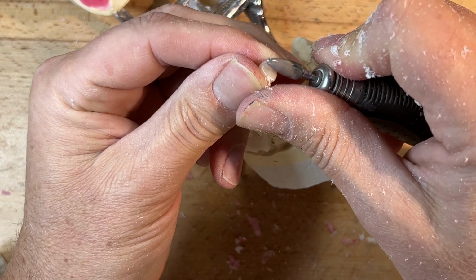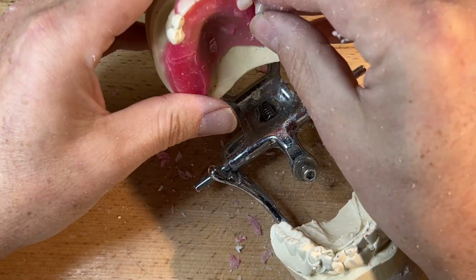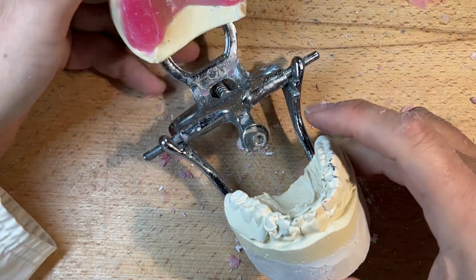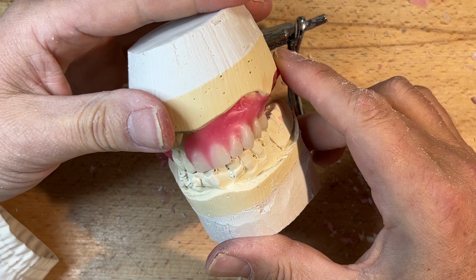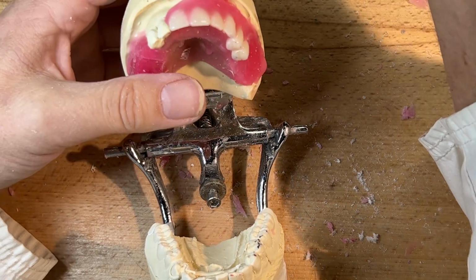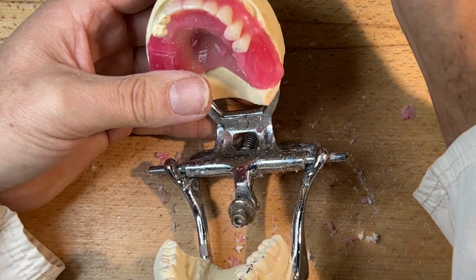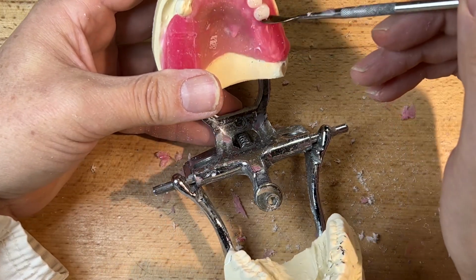Lateral excursions, protrusive movements. Because they're using the denture teeth for multiple purposes, sometimes you might have a buccal cusp lower than the other because it was used for many situations. It's really advantageous sometimes in a partial denture situation to have this elongated buccal cusp. But sometimes in the full upper, full lower, we can reduce that, depending, again, on the manufacturer of the denture teeth.